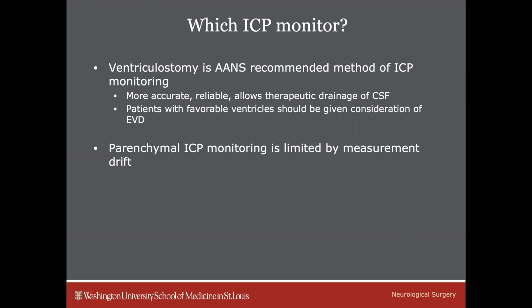So placement of an EVD can be technically challenging. And the second issue is that it has higher incidence of complications. We rarely ever see an infection or an intraparenchymal hemorrhage related to an ICP monitor, whereas with EVDs, we see it often. So, again, it's a better modality, but also has slightly higher risk.